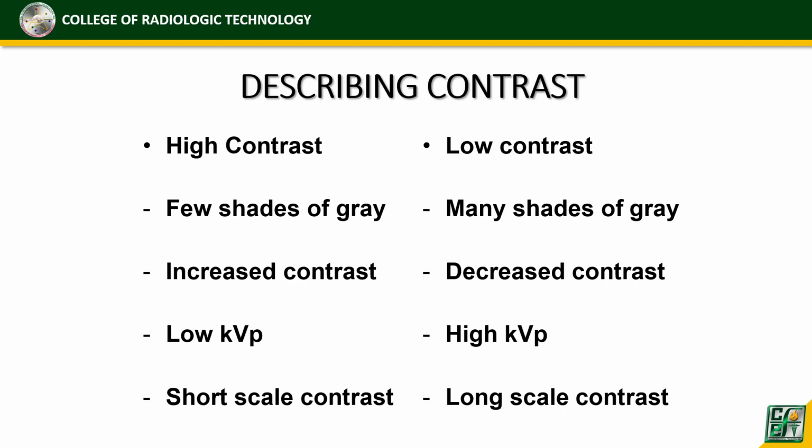Low contrast, decrease ang contrast because there are many shades of gray na halos magkakaparehas na sila ng shade or ng color. Diba? So there are limits to the visibility of detail in the image.